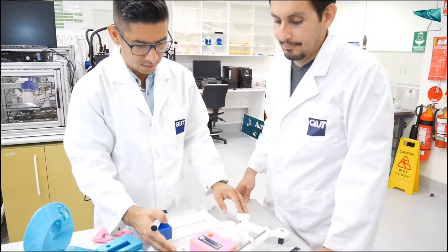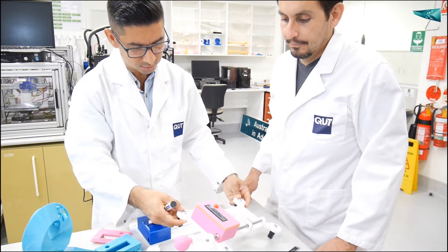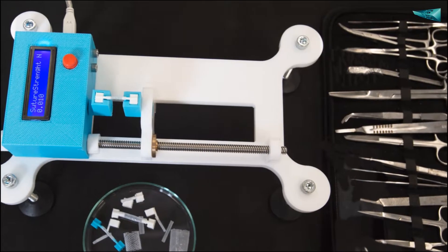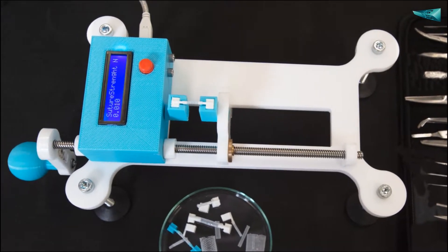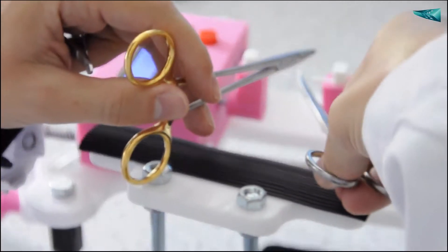All these drawbacks of existing training devices motivated us to design the first ever training platform which is versatile and accessible to everyone. We designed our device to be portable so everybody can advance their suturing skills with ease, regardless of whether at university, at home, or with fellow medical students.